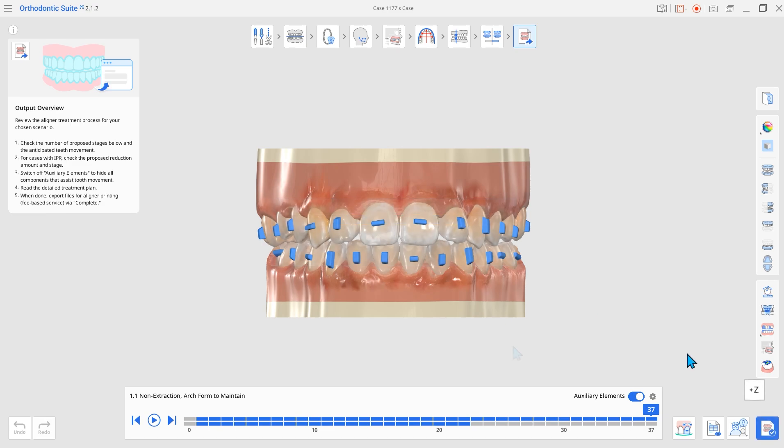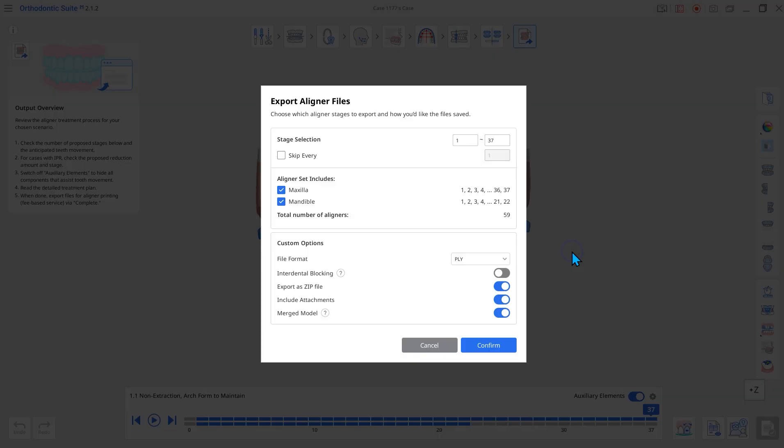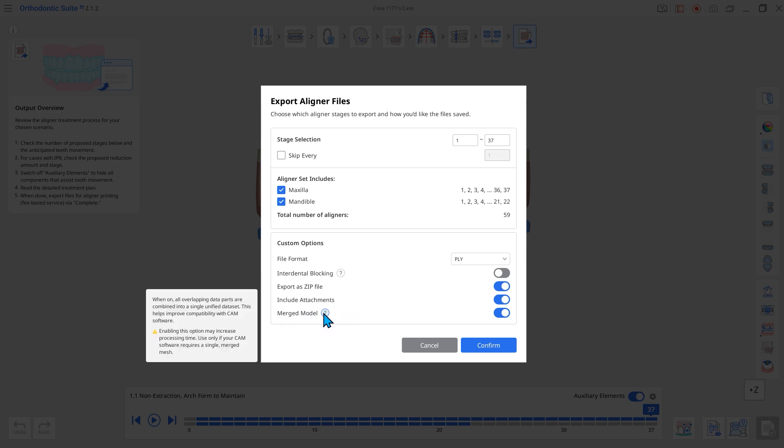Fourth, a new option for merging the model has been added. In export aligner files, you can select the merged model option. This combines all overlapping meshes into a single unified model, improving compatibility with various CAD software.